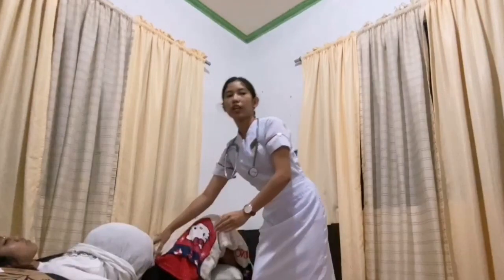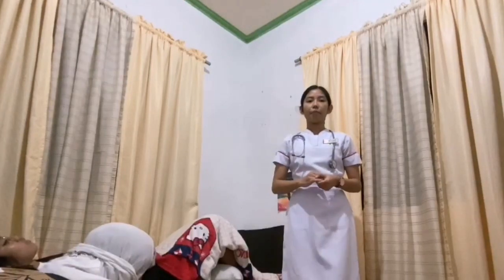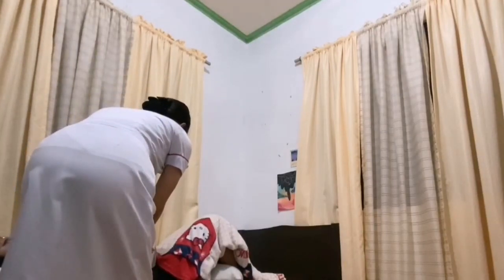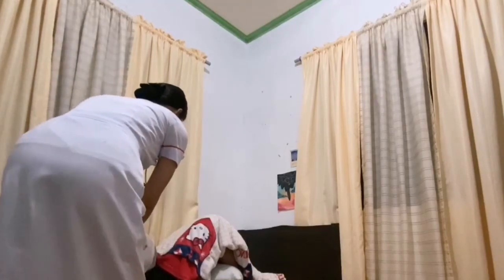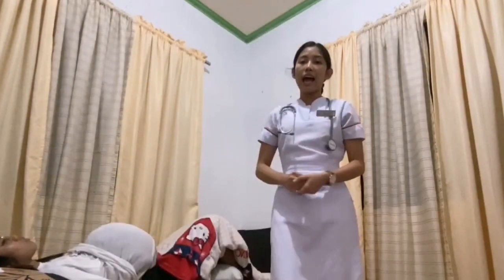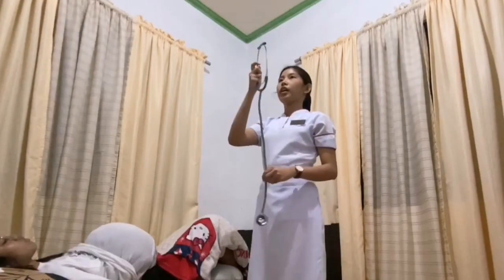So the baby is engaged. After that is the fourth maneuver or the pelvic grip. Turn and face the woman's feet to confirm the findings of the third maneuver and determine the flexion of the fetal head into the pelvis. The cephalic prominence is felt on the side where there is greater resistance to the descent of the vertex. The place where the resistance is greatest is where you can locate the fetal brow. After that, locate the back of the fetus and place the stethoscope over it and listen to the fetal heart tone for one full minute, using the diaphragm of the stethoscope.